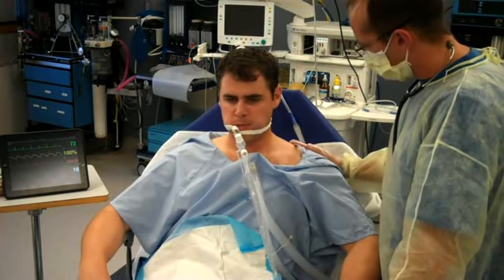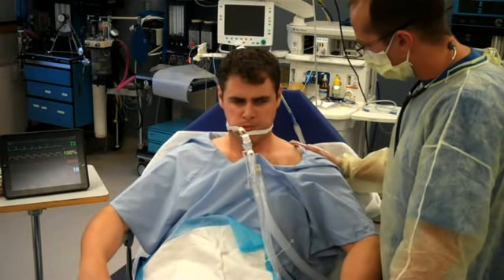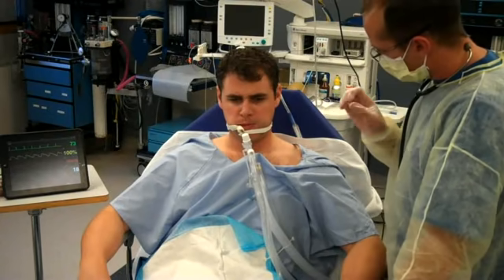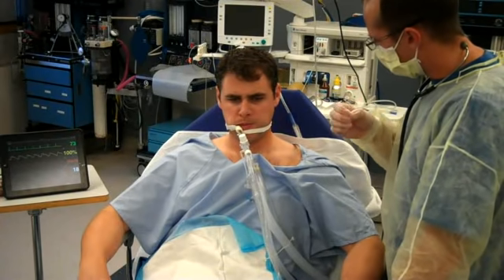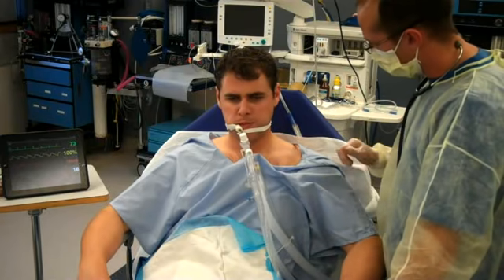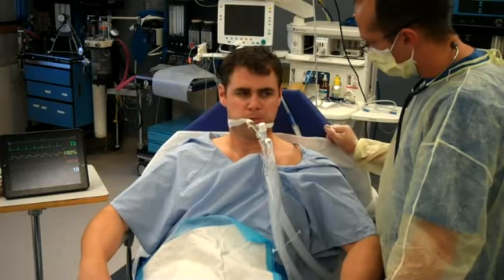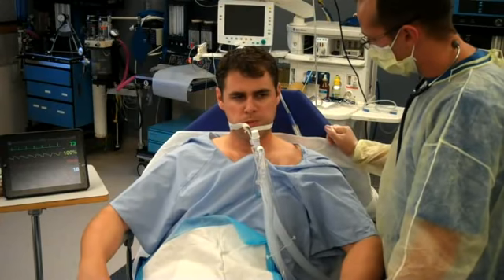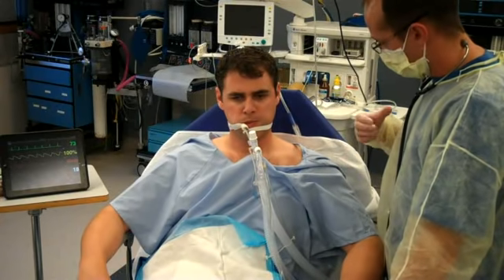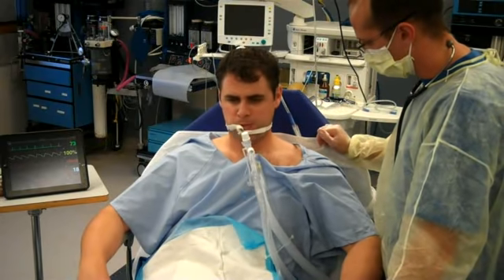So what we're going to do is we're going to take that tube out now. What I'm going to do is have you take a couple of nice deep breaths in. When you're taking that deep breath in, there's a little balloon around that tube in your mouth. I'm going to pull that tube down, pull that balloon down, and get rid of all the air inside of it so we can pull that tube out. Once that tube's out, I want you to take some nice deep breaths and cough anything in your lungs out to clear that up.